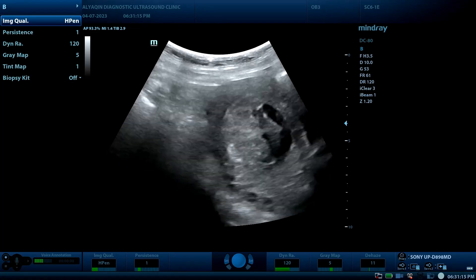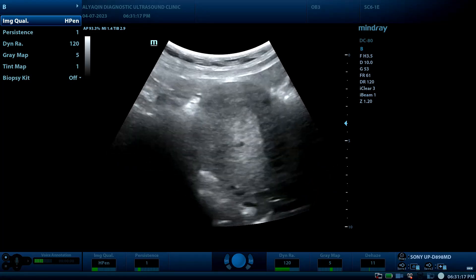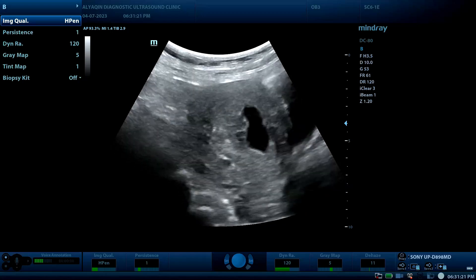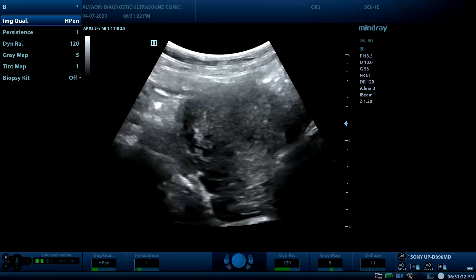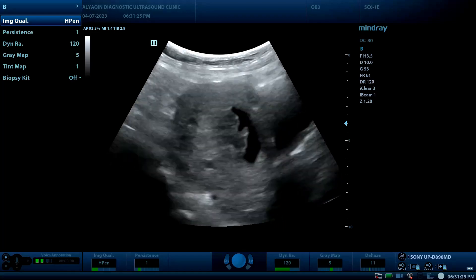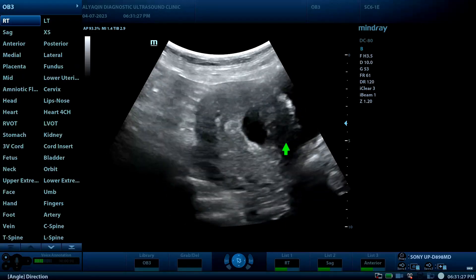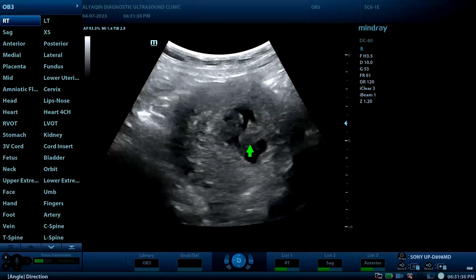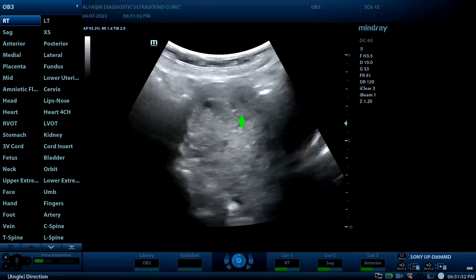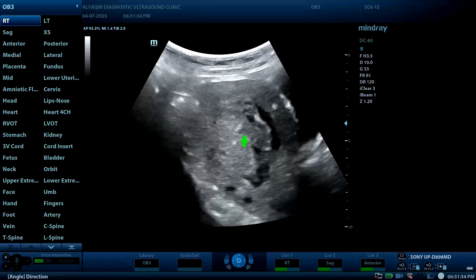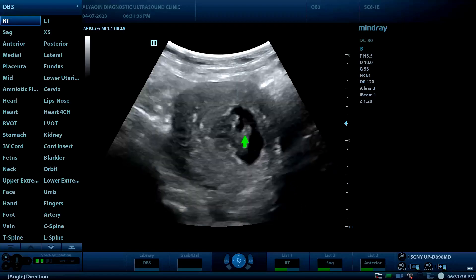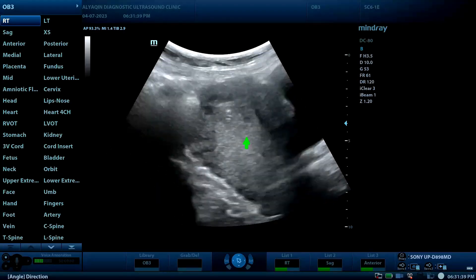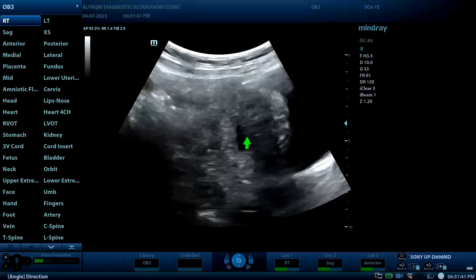This is a case of suspected molar pregnancy. There is a gestational sac with an irregular shape and severe bleeding. There is no viability.